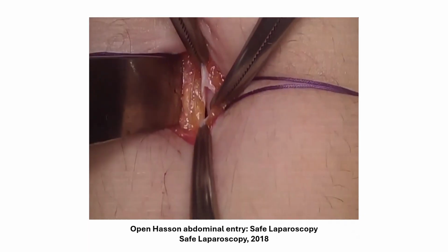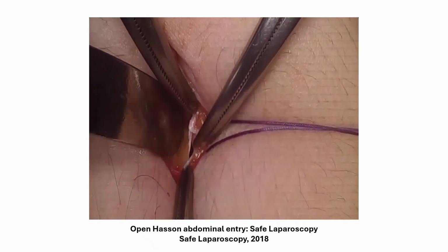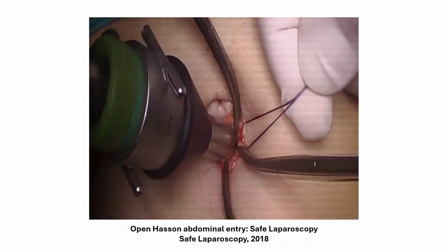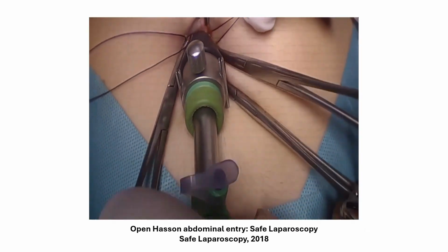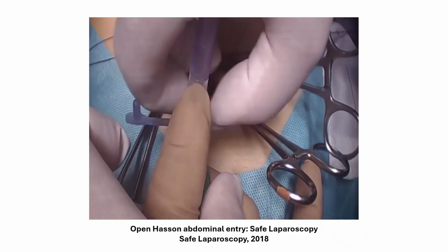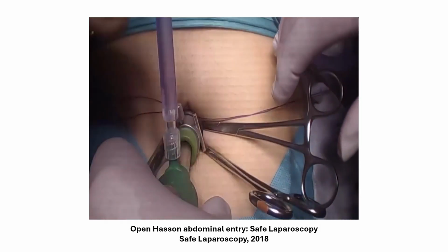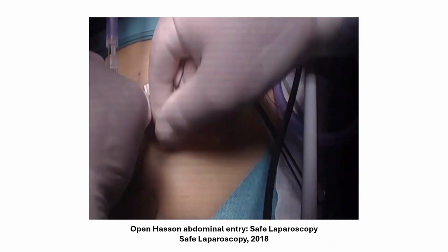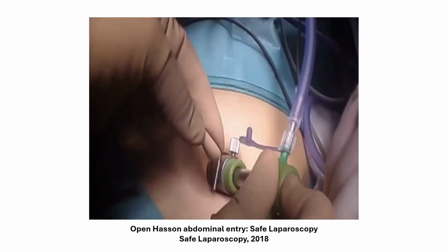We just need to make one last cut, and we should be in the intra-abdominal space. Alrighty, and this is why. Once we put in the trocar and the port, we'll be able to anchor that port site down with those sutures by tying them on either side of the port, as demonstrated here.